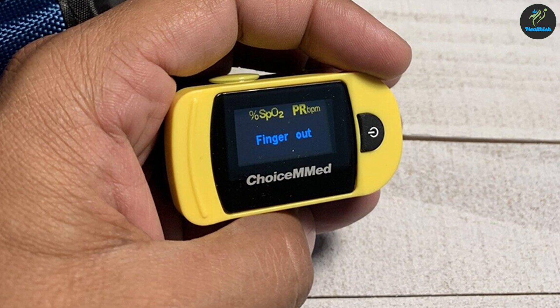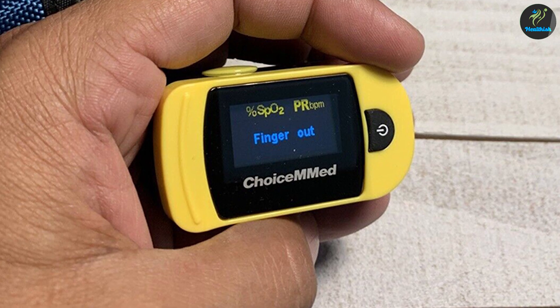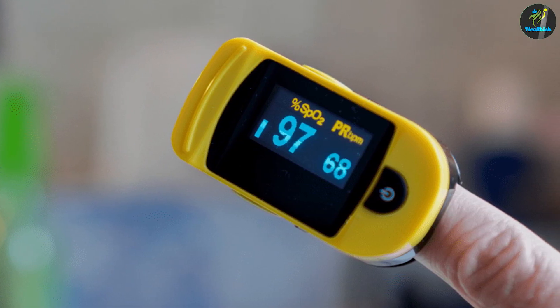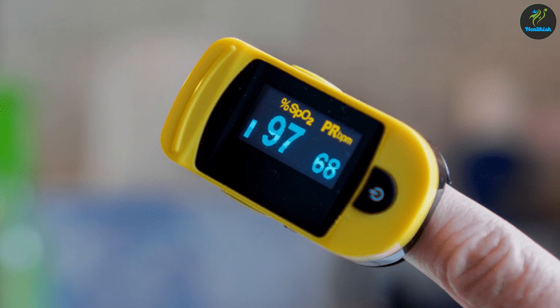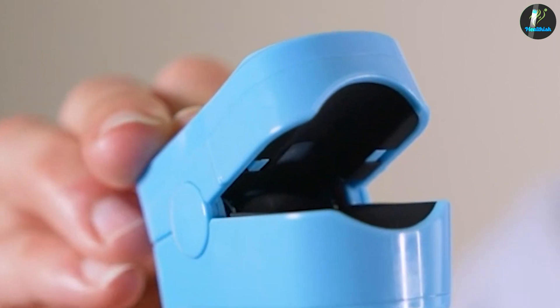When it comes to measuring oxygen saturation levels, pulse oximetry is a great option for those with respiratory and cardiovascular problems, infants, and people with infections. Pulse oximeters are small, portable devices that measure the amount of oxygen in the blood by using a sensor that clips to a fingertip.